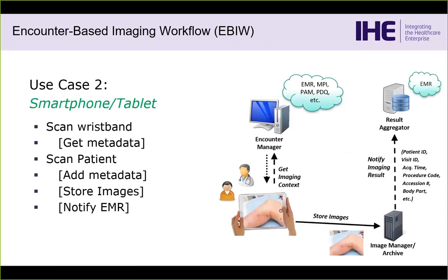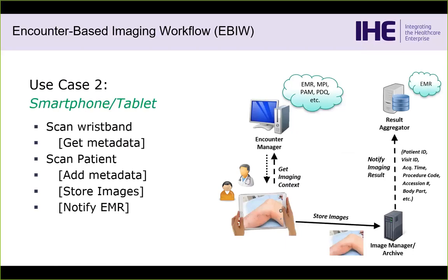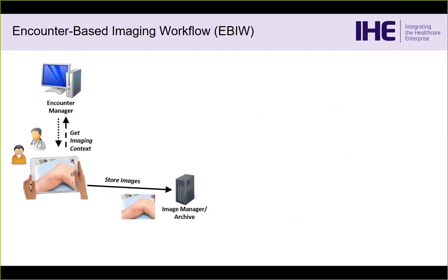So you may not have noticed the change there, but same flow essentially for the smartphone and the tablet. So we go from having an ultrasound cart to, say, a tablet in dermatology or a wound care area, and same thing works, that they query for the metadata, they put it together with the images, they fire it off for storage. So the flow is the same.